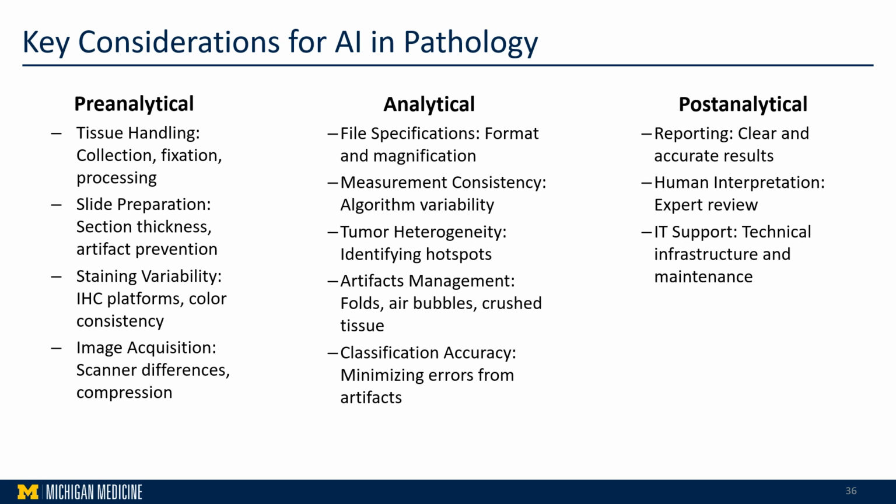And so, if the machine learning models are trained without real world data or without any of the pre-analytic variables that typically happen in every lab, you might expect performance on real world data that might not be as high as it claims.